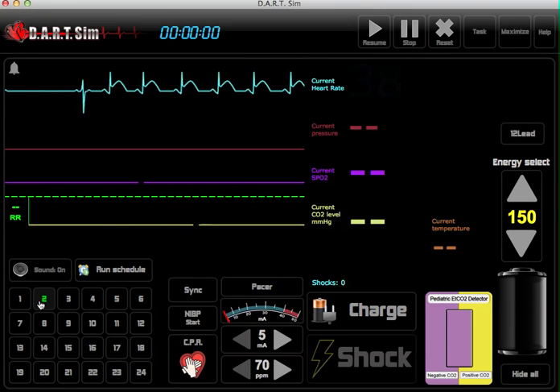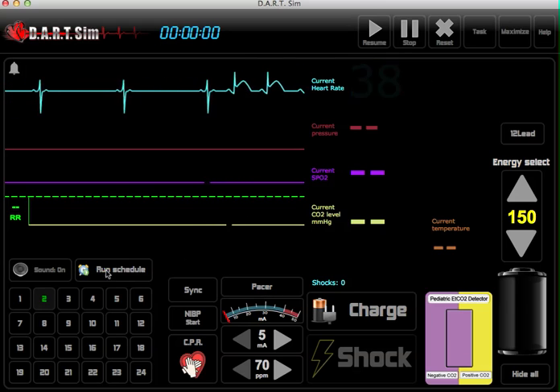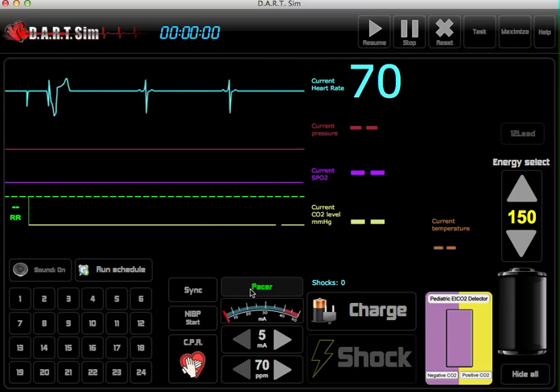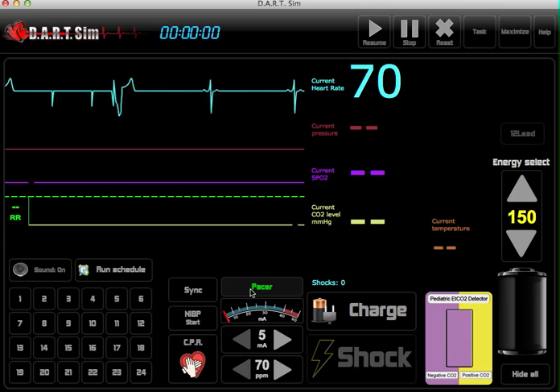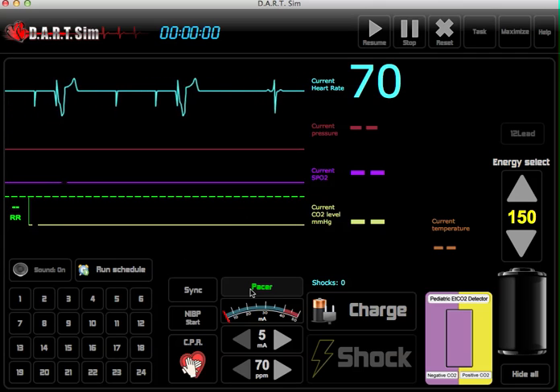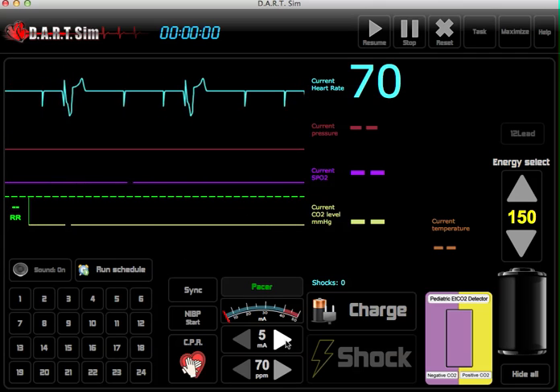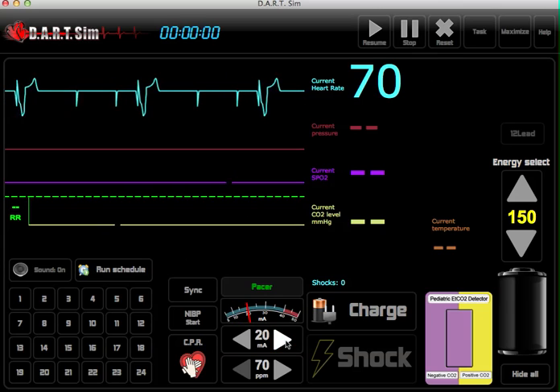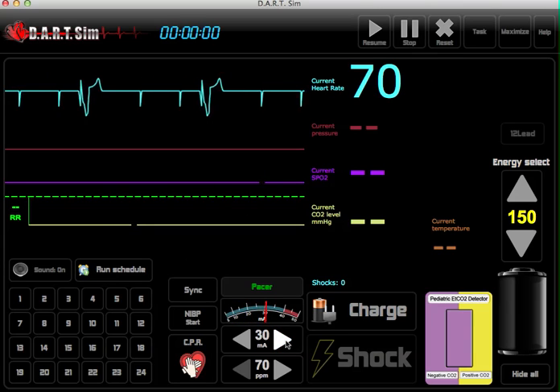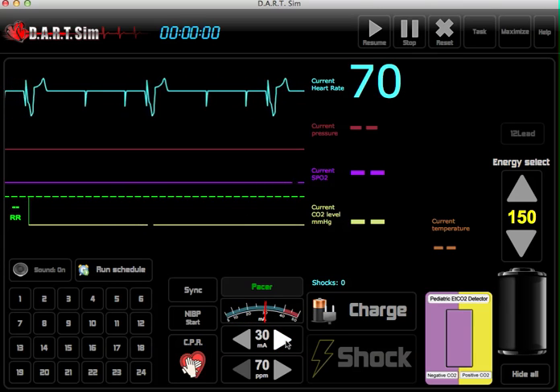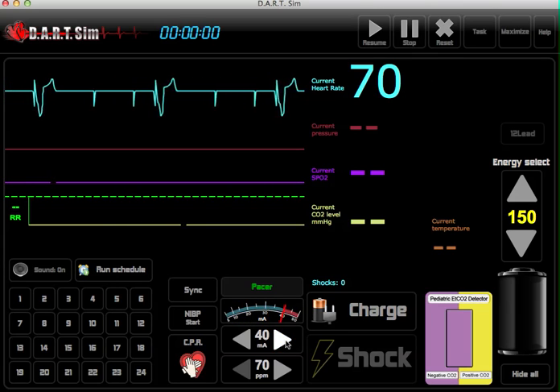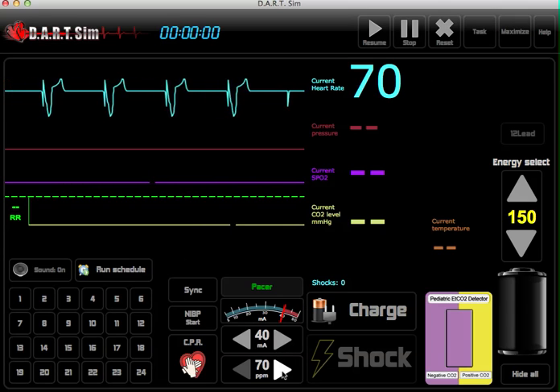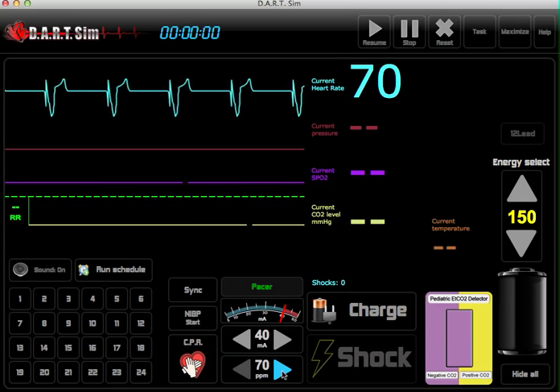We also have a pacer function. Once the pacer is activated, you then have to increase the milliamps in order to see full capture. And once you have full capture, you can also adjust it right here below.